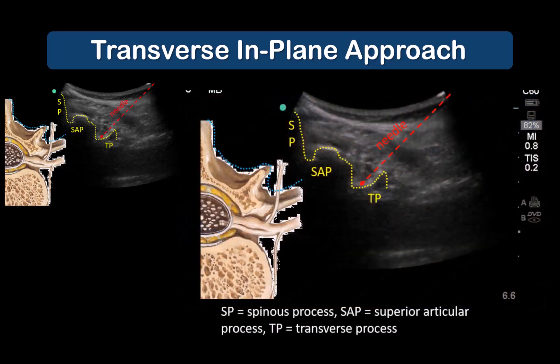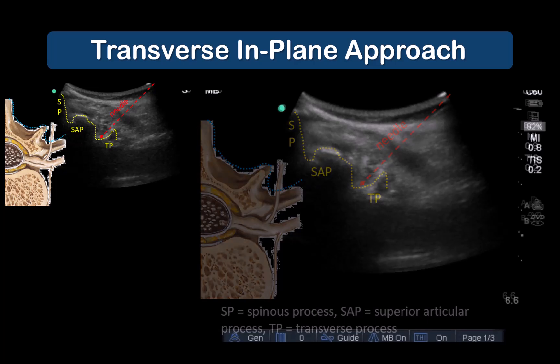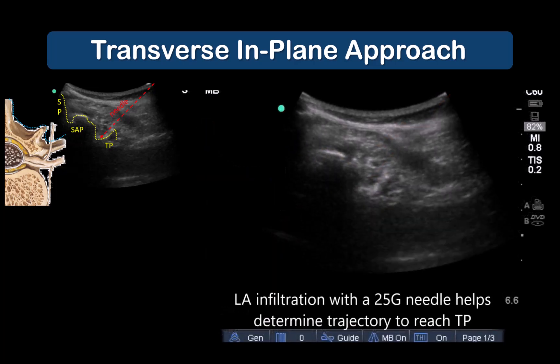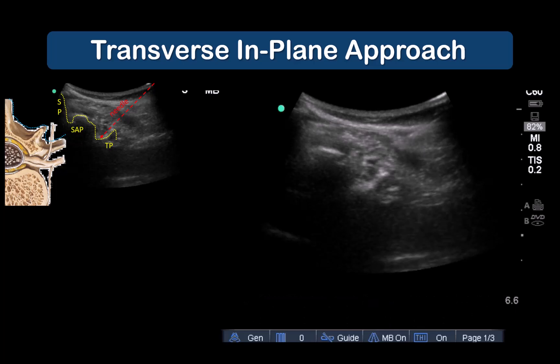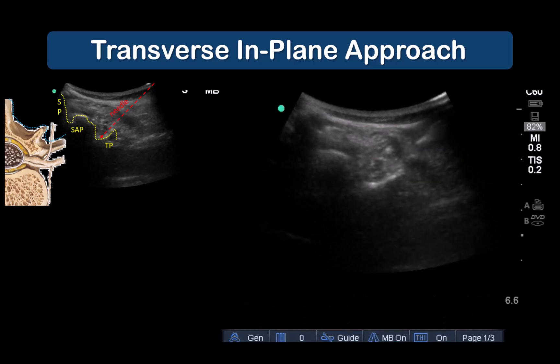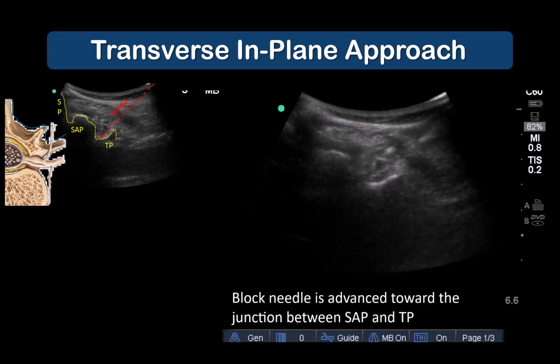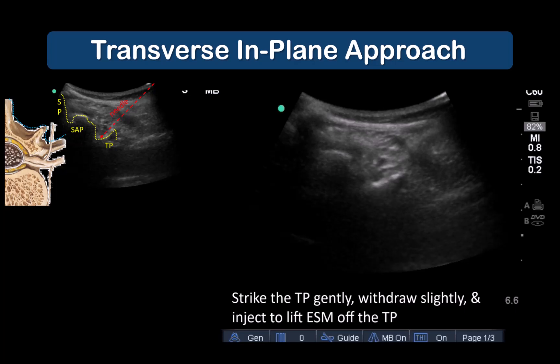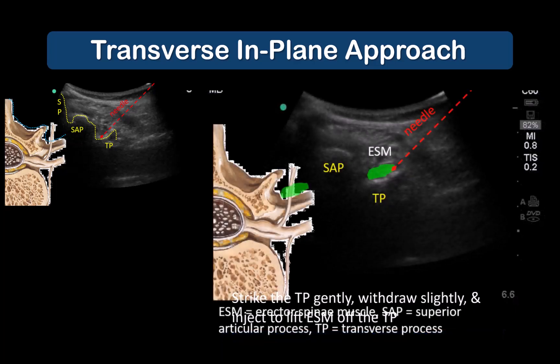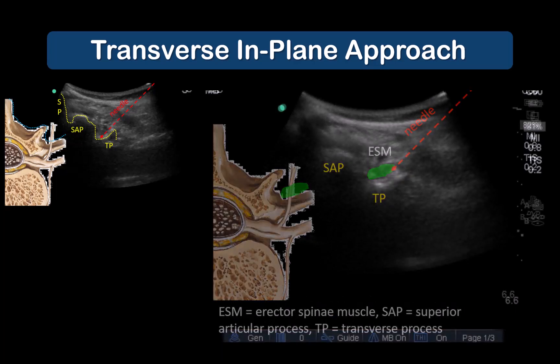In this case, the articular process and transverse process are visualized and the aim is to land on the middle half of the transverse process close to this junction, which is where the dorsal ramus emerges and branches out. The endpoint for local anesthetic injection is spread between the erector spinae muscle and the transverse process.